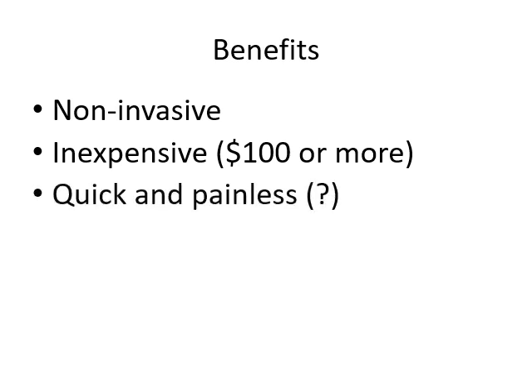It's quick and painless. Now, I have that in question marks because if you've ever had to get an ultrasound on a full bladder, so if you have bladder issues or you go for a prenatal ultrasound, they make you drink a pile of water and then you have to just hold that bladder in there because they want it nice and full so it gives a better image. And when they're putting that probe in there, it's kind of painful. But it's, again, nothing compared to doing surgery.